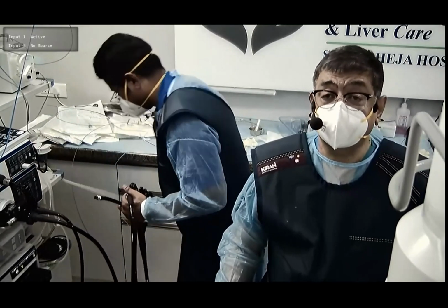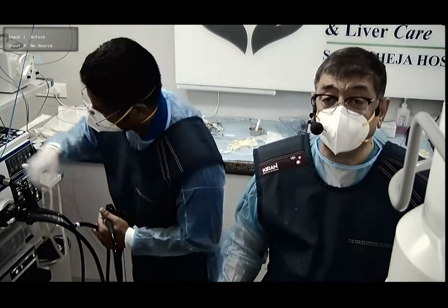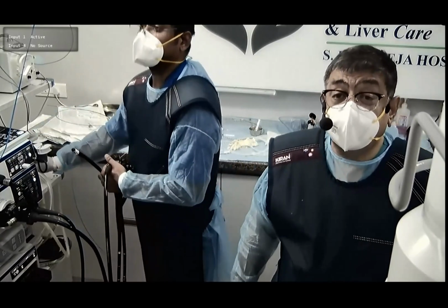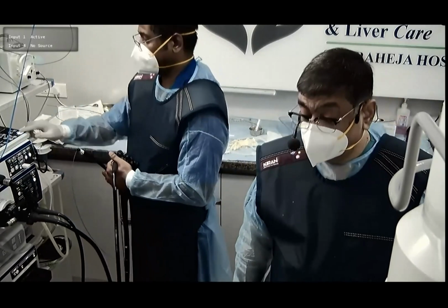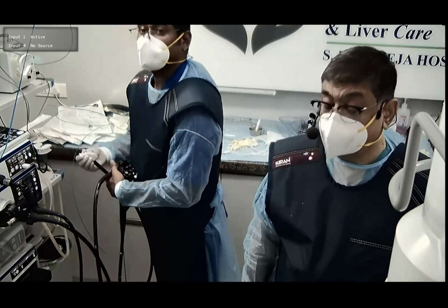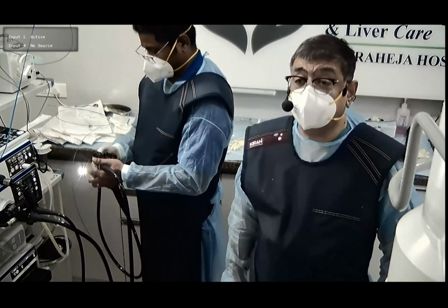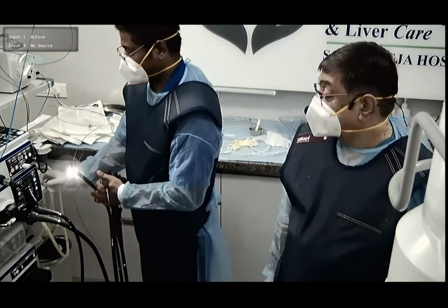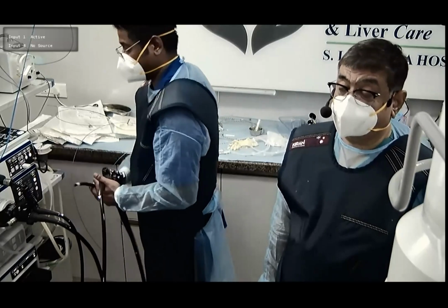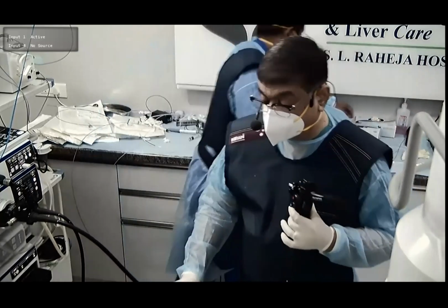So almost all the relevant procedures, vascular therapy we have not included. It can be included without much problem. Gallbladder drainage can be included in this, should not be a problem. So I think we have found the base for a single model for all interventional EUS procedures, and further refinements will help us improve our training very much. So again, I'll go into the esophagus. EUS, please.